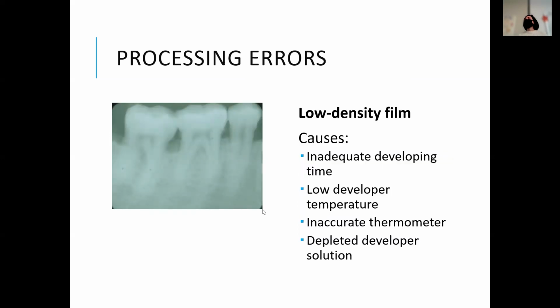Low density causes could be just not spending enough time in the developer, the temperature being too low, too cold, and the developer solution being old. They have to change it, I don't remember, once a week or once a month, a certain amount of time. And if they don't stay on that, they have to clean it. The rollers can get dirty. Everyone always hated it when it was time to deal with the processor. And the chemicals are kind of nasty too. They're kind of stinky. So it's nice that that's really not a thing anymore, frankly, but those are issues.